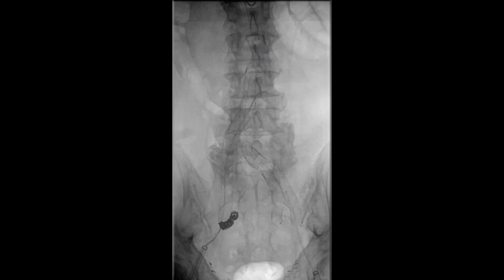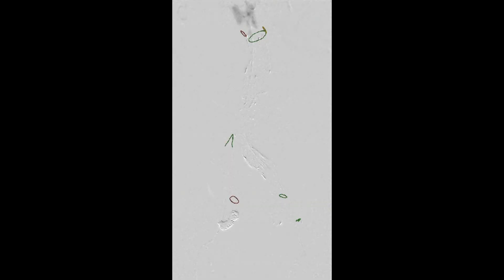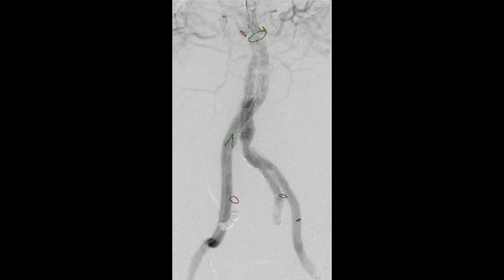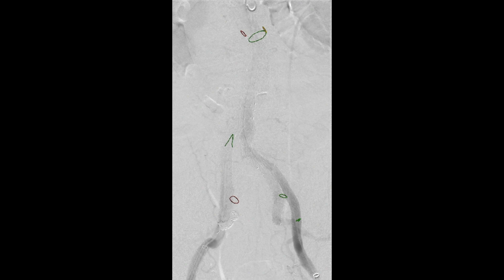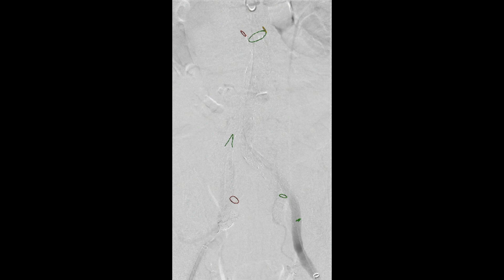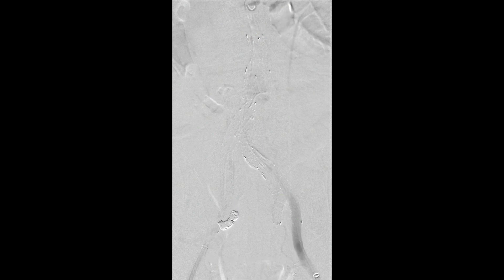Once this is completed, a final completion angiogram is then performed to evaluate for any type 1, type 2, or type 3 endoleaks, and to confirm successful exclusion of the abdominal aortic and bilateral common iliac artery aneurysms.